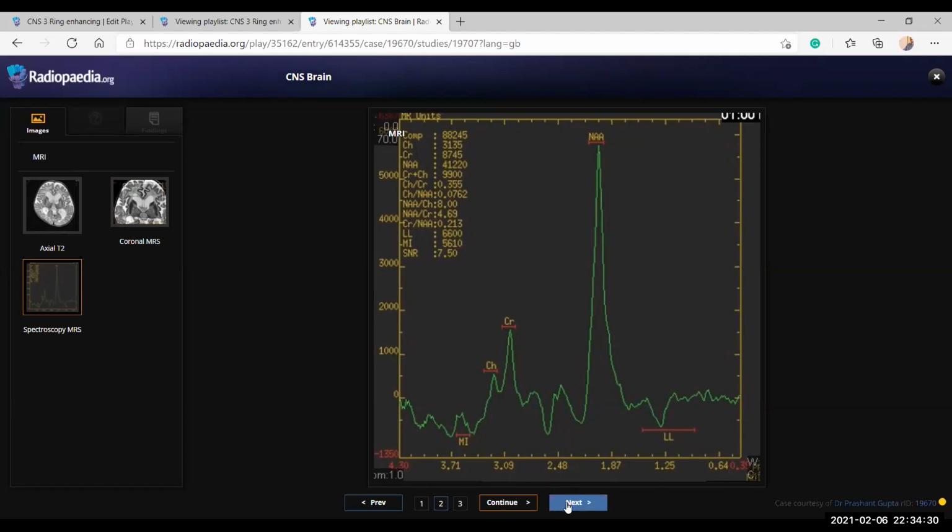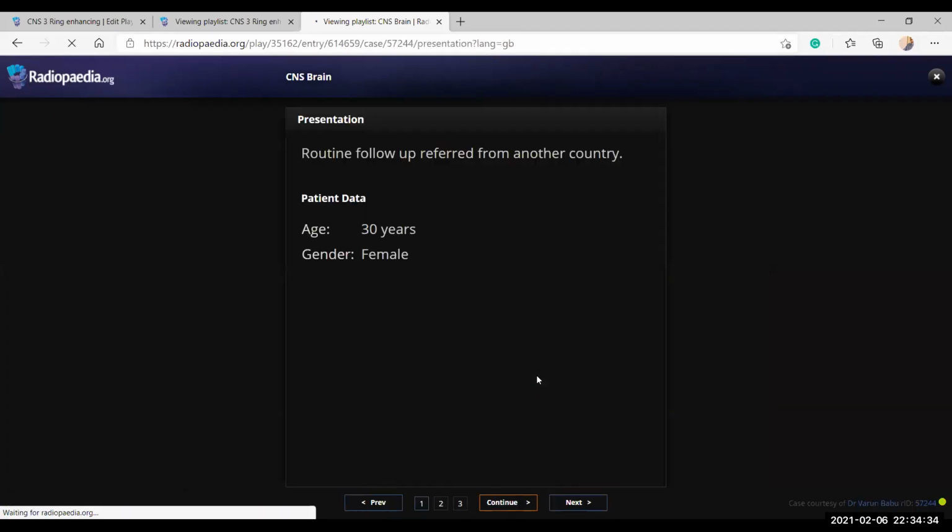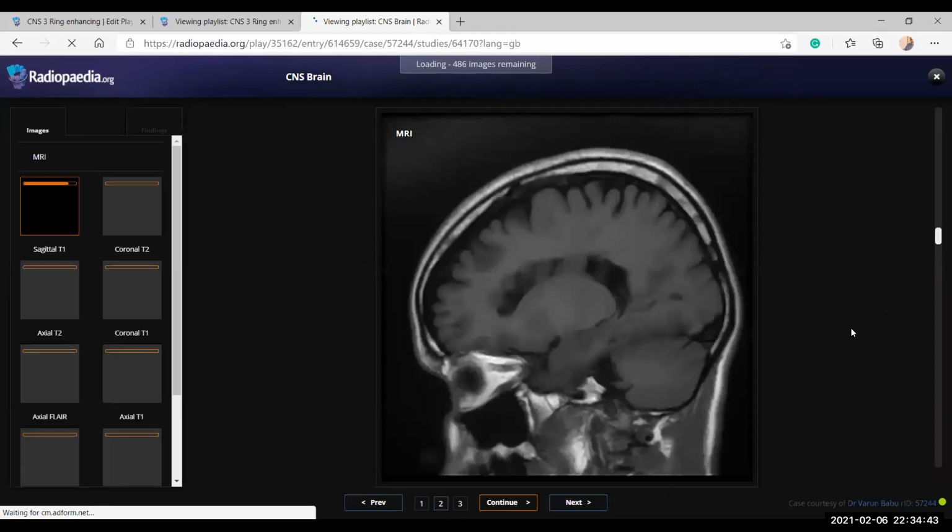Okay. We have 18 seconds, up to you guys. So this is the last case. Sure. Okay. Routine follow-up referred from another country.